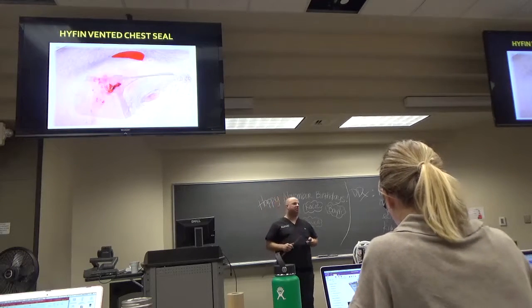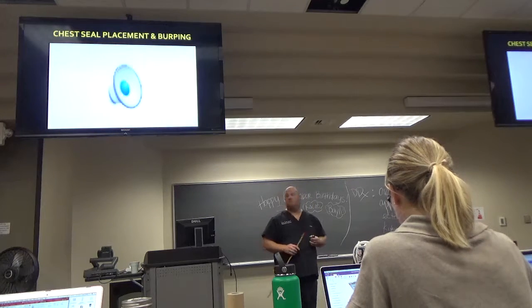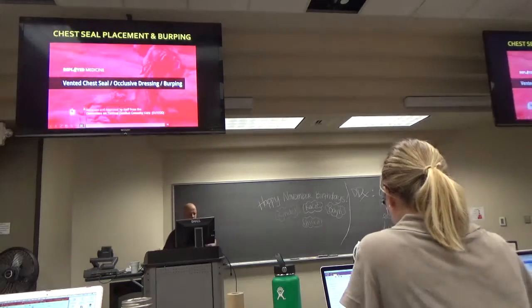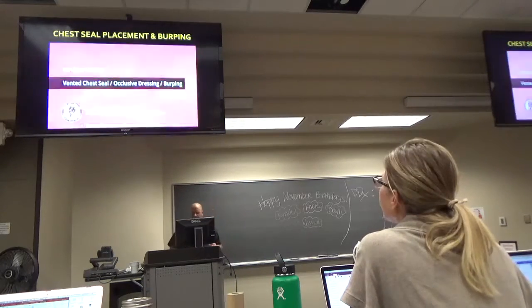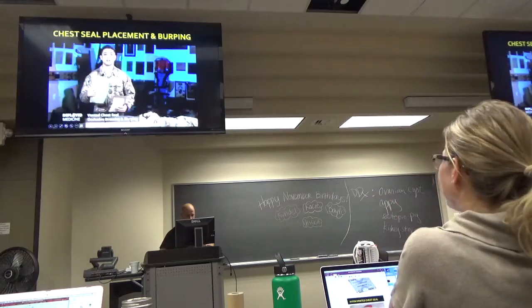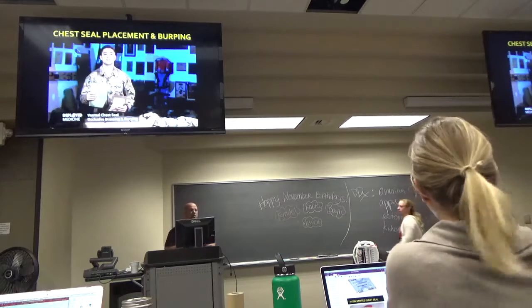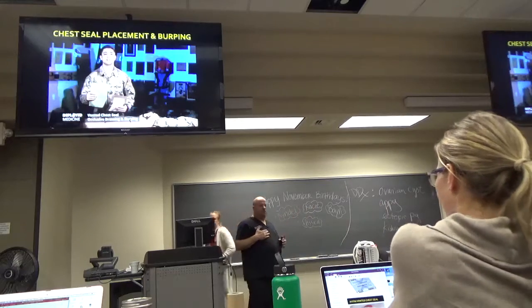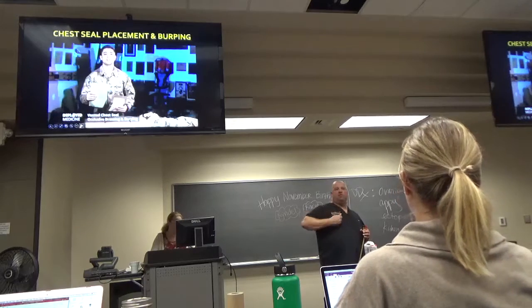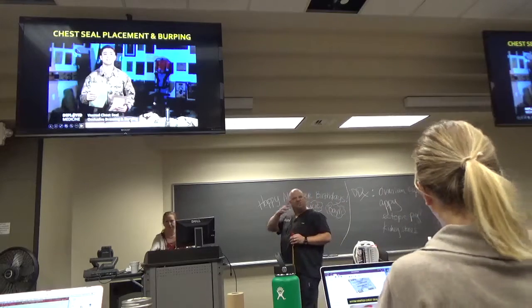This is a HyFin chest seal. Sometimes, if you're out somewhere and you don't have a vented chest seal, or you do have a vented chest seal and lots of blood, they'll call removing it burping the chest. So burping the chest wound is what they call it. And this is a little video to talk about that.